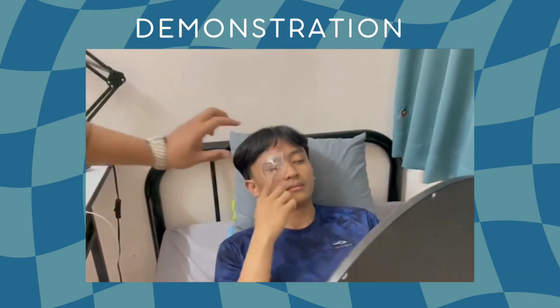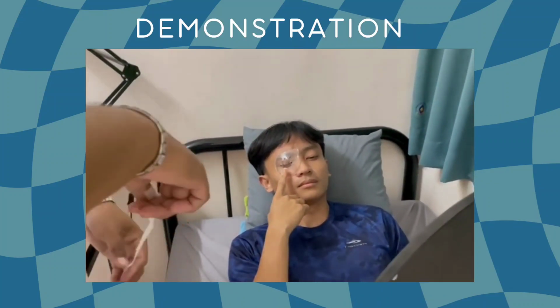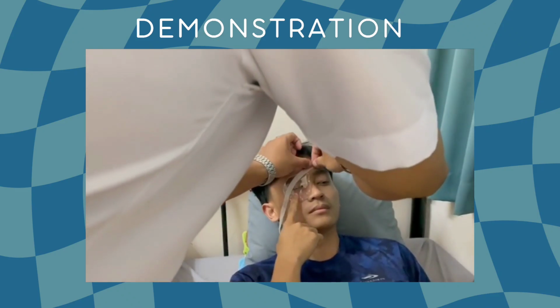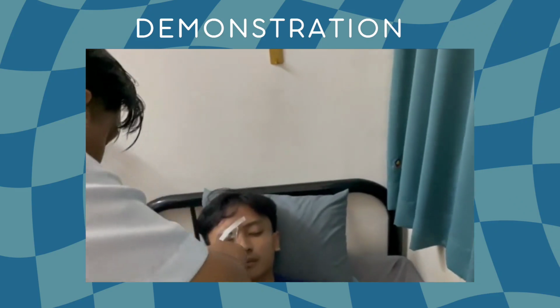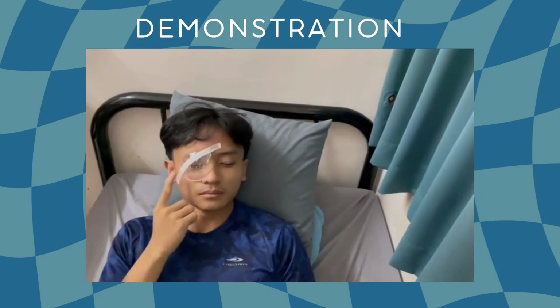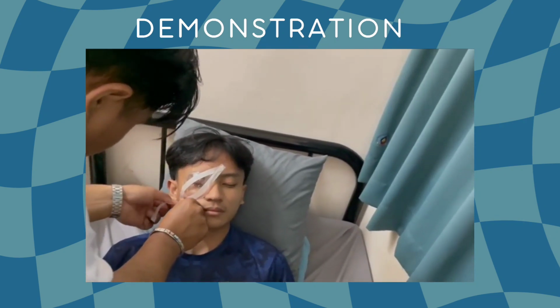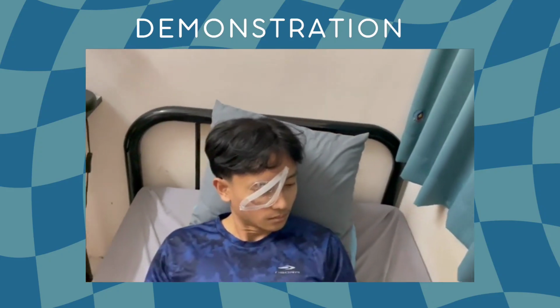Right. So, by using the micropore, I'll stick the first one on the top without blocking your view. Then I will cut the excess. Right. Here. Here. Then another one, at the bottom. And right here. Without blocking your view. So you can still see through the eye shield.